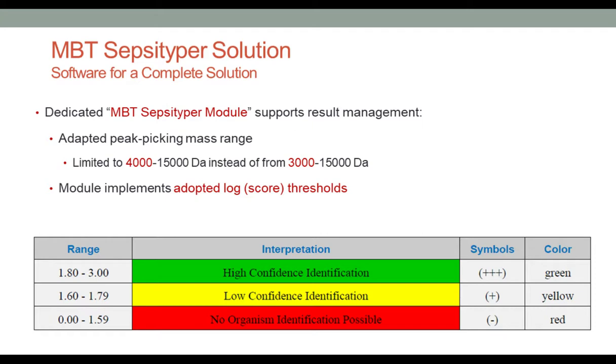Well, since we're not using an assay that detects resistance markers, we don't have that now. Like I said, we have tested our Staph aureus, but we're using a different test to do that.